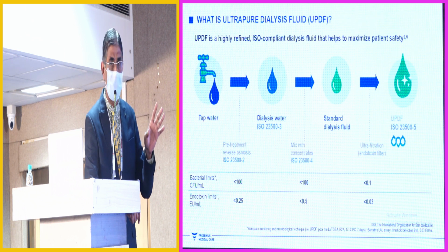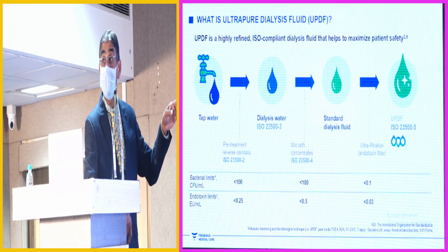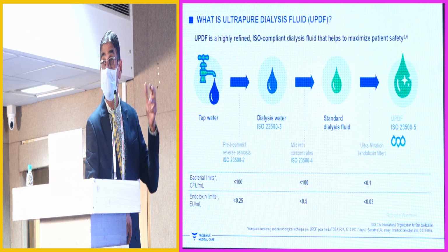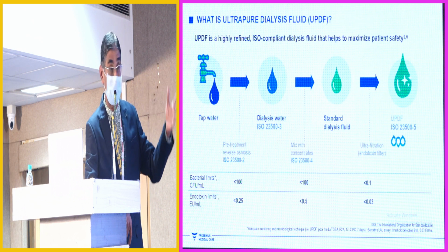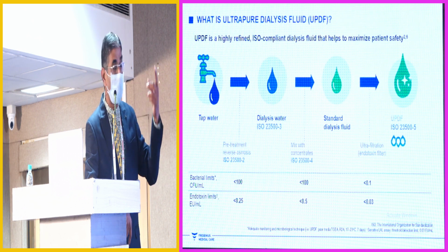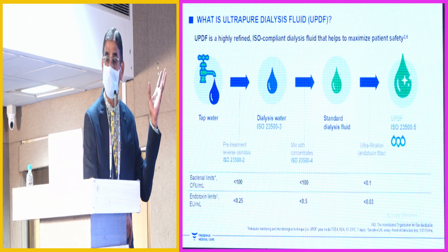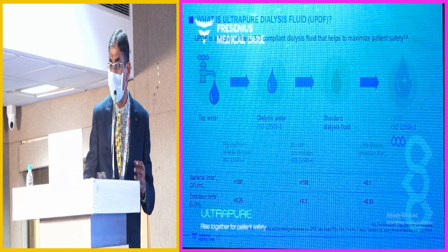They do the disinfection. Monday morning, I used to get a lot of problems, because inside the RO tank you have the grandfather, the grandmother, then the grandchildren, the father and the mother, all swimming and happily living. In the morning, they go and disinfect. Monday morning, I get the headache because all this happens. So how to achieve it?